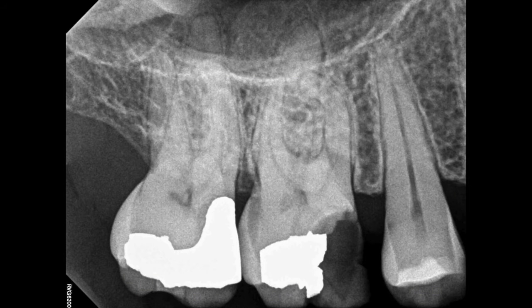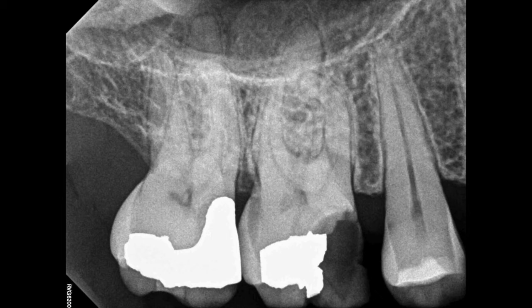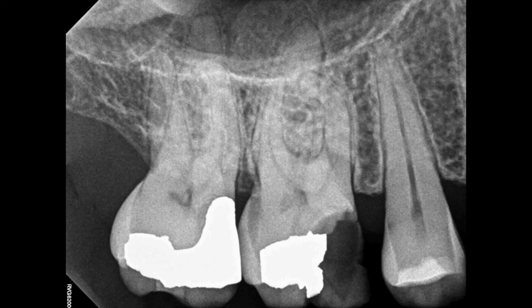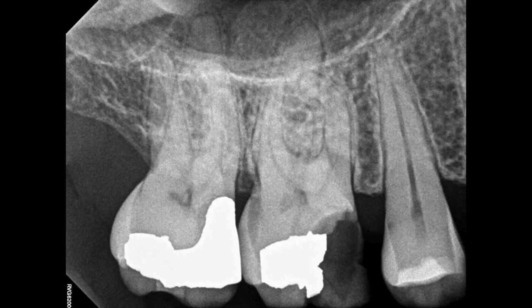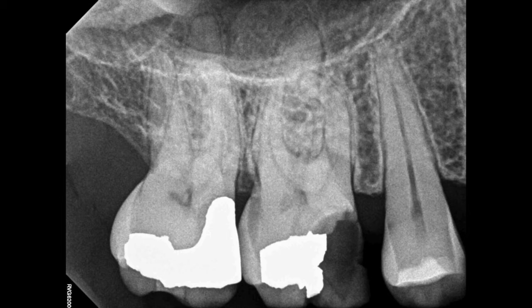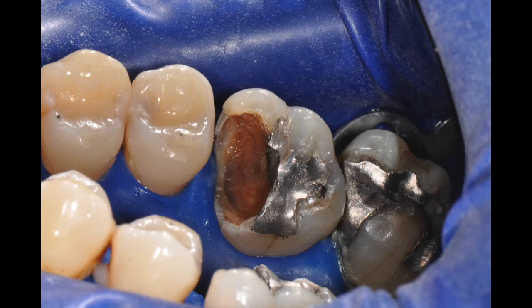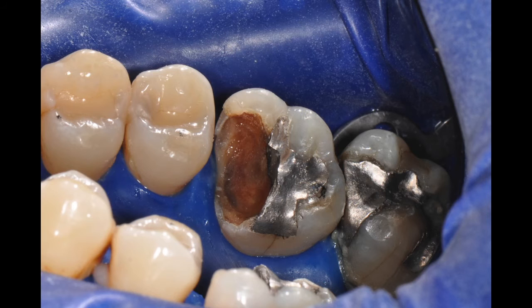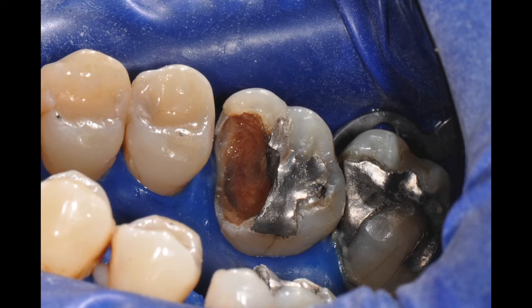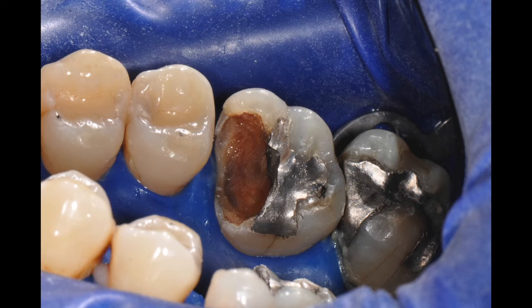In this case study we tested the adjacent teeth to establish a baseline of the patient's thermal sensitivity. All teeth responded similarly to cold without lingering discomfort. Following our restorative analysis, anesthesia is achieved and the rubber dam is placed for isolation and patient comfort.